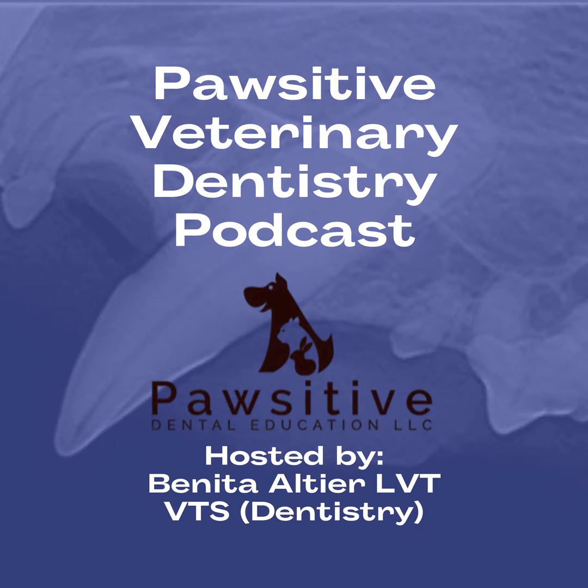Absolutely. I think it might even start a little bit before that, Benita, with having a grasp of what you should be looking at, knowing the number of roots that should be present, knowing what direction those roots should potentially be pointing. Then when I am teaching dental radiographic procurement, or taking those images, we look at a few different things. We look at contrast. Is the image too light or is the image too dark?